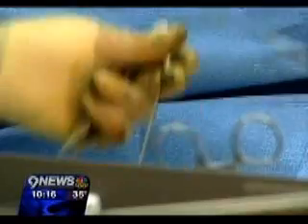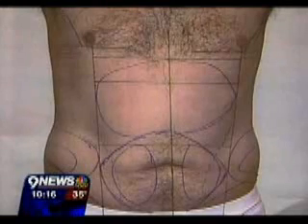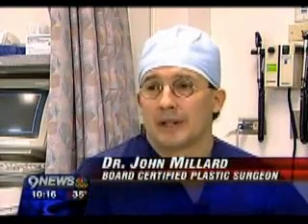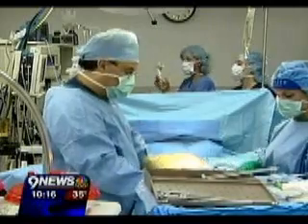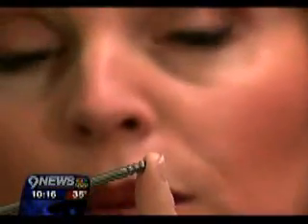After months of research, John O'Brien is having liposelection, high def brought to the body to put fat in its place. This is a genetic fat that in the 21st century, in the time of drive-thrus, and we know where our next meal is coming from, really isn't, it's sort of residual leftover. Dr. Millard selectively removes fat along the contours of muscles in John's abdomen, sides, flanks, and pecs. This is what makes high-definition liposelection possible.